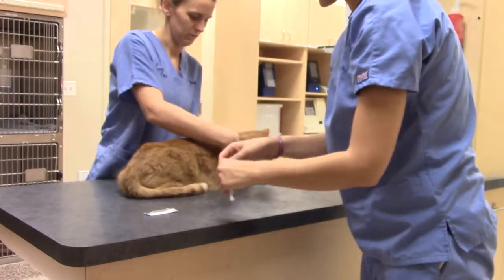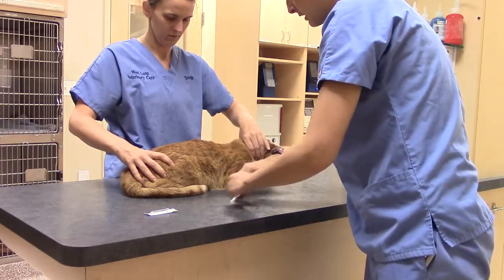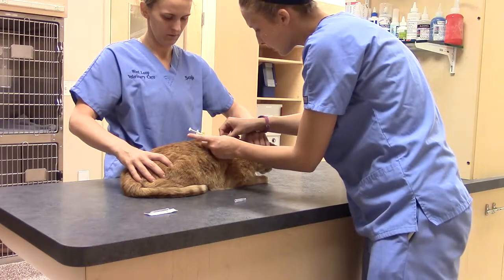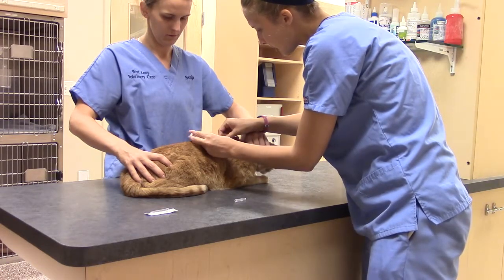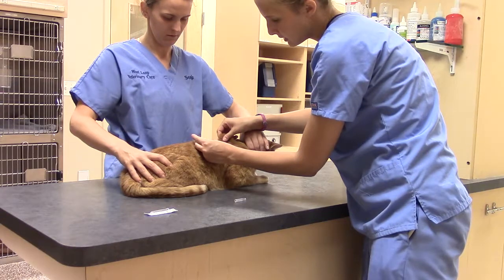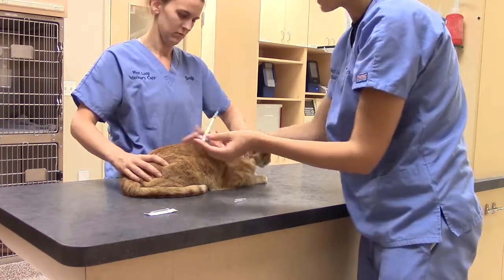I'm going to go ahead and tent the skin, take off the needle cover, go ahead and poke, pull back. No blood was aspirated, so I'll go ahead and administer, rub, and he's good to go.